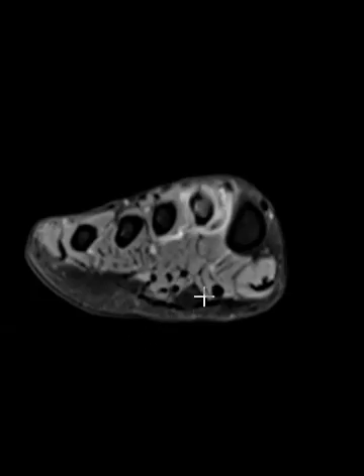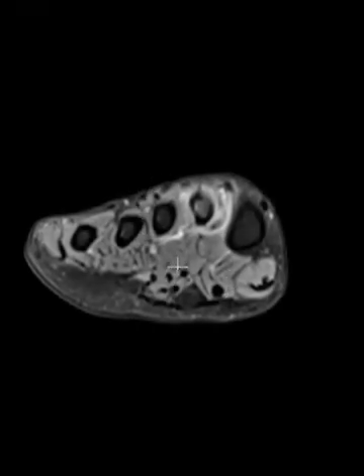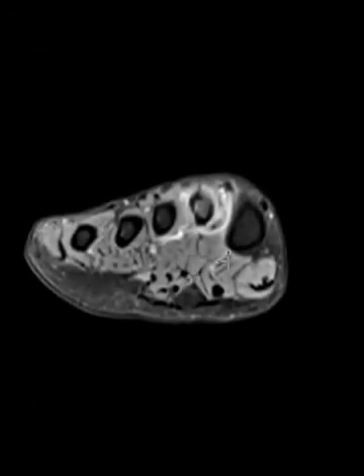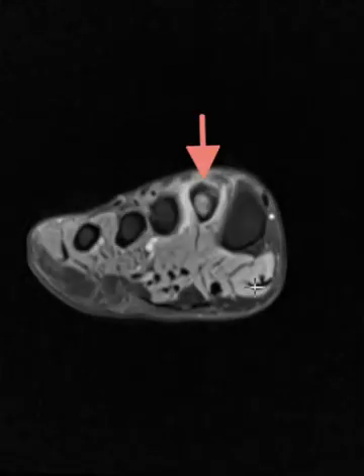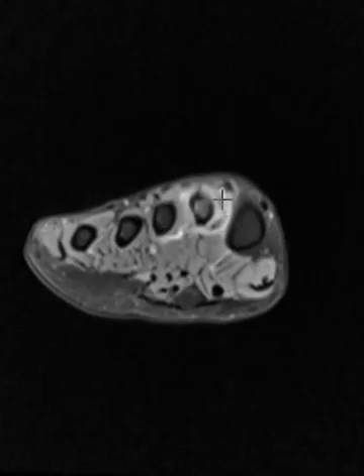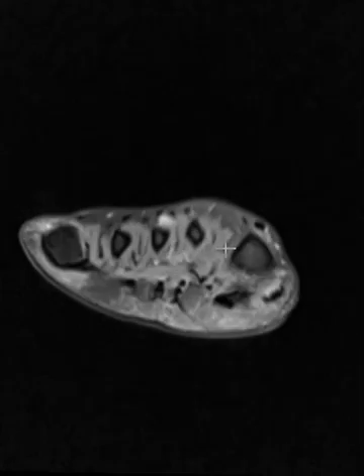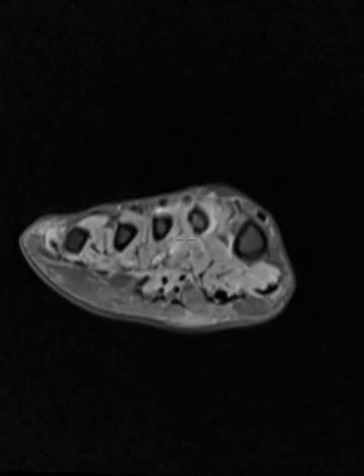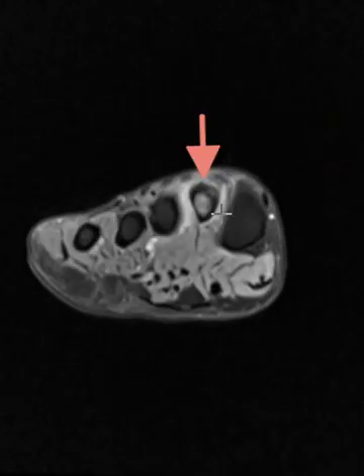We also look for ganglion cysts — those are not uncommon. We see little fluid pockets around sometimes that are ganglion cysts. Sometimes patients seem to have tumors that look like cysts or solid masses, and when we do see a tumor or something that may be a tumor, we'd like to give contrast to see if it enhances. This is that metatarsal stress fracture in this patient — you can see that the muscles around it are gray with brightness, so the muscles are also injured. That's very common. So just a quick video to show you what we look for in MRI of the foot and some of the pathologies. This patient happens to have a congenital bipartite sesamoid bone and a metatarsal stress fracture. Thank you very much.